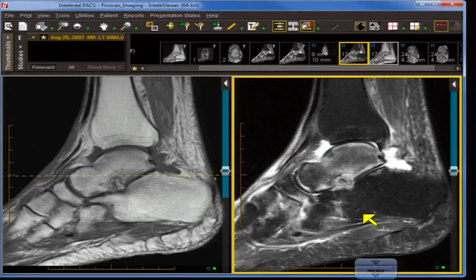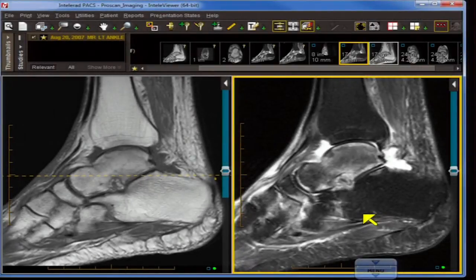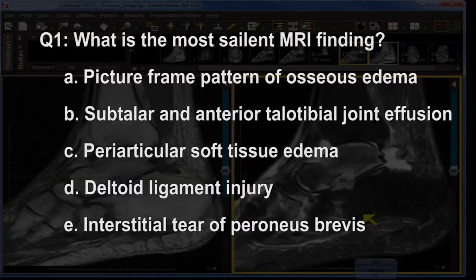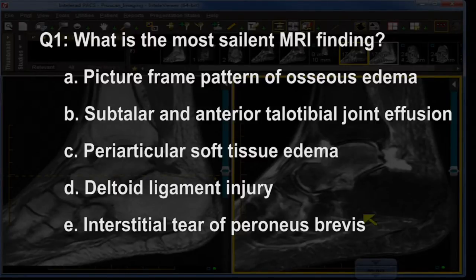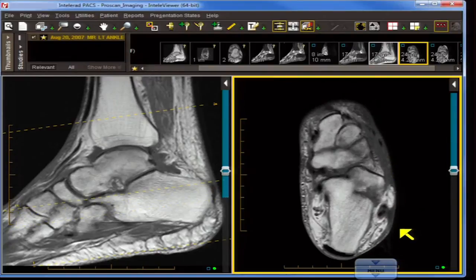Let's go with the first question: what is the most salient MR finding? I'd like the audience to gaze on these two images — a fat-weighted image on the viewer's left and a water-weighted image on the viewer's right with excellent fat suppression. The choices are: picture frame pattern of osseous edema, subtalar and anterior tibiotalar joint effusion, periarticular soft tissue edema, deltoid ligament injury, or interstitial tear of the peroneus brevis.